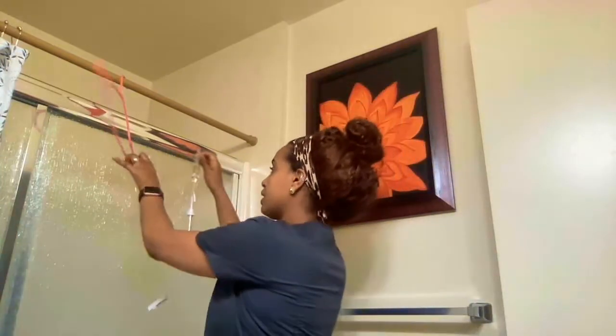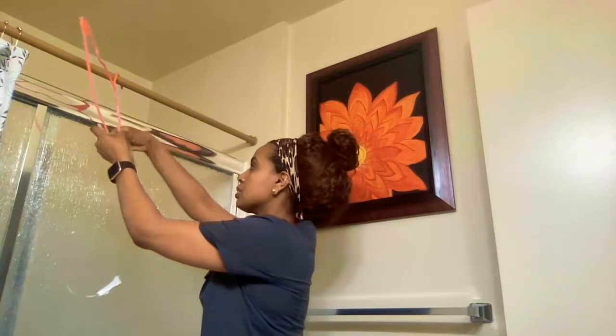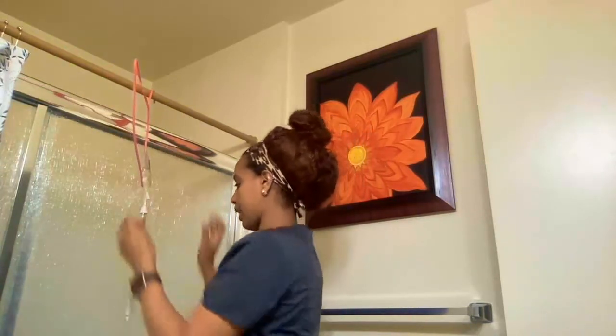We always want to make sure we hang the medication bag higher than the primary bag, because we want the medication to go to the patient first. Always hang the secondary piggyback bag above the primary — secondary before primary.